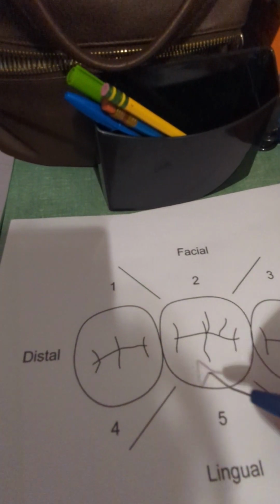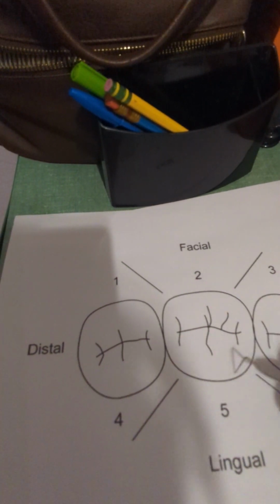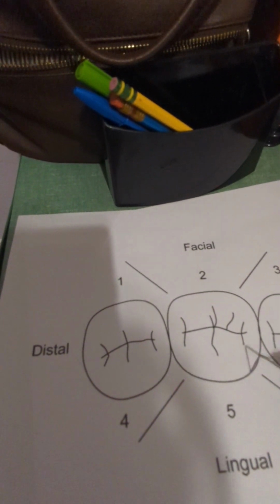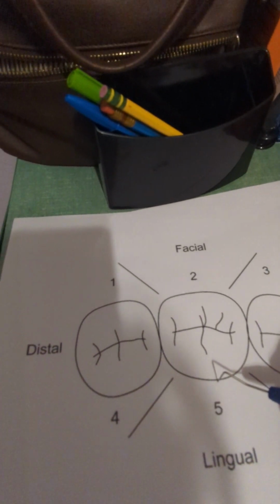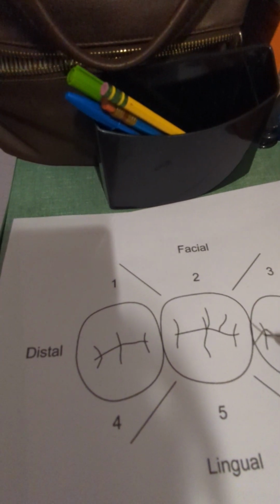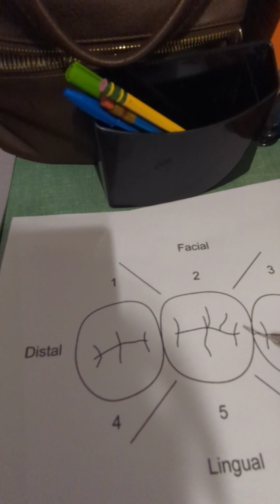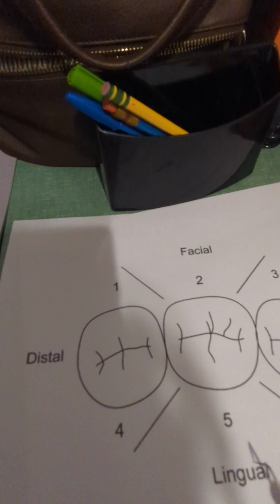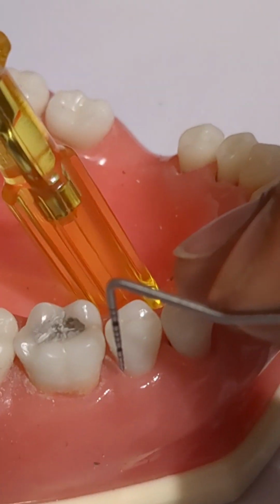Now, for the lingual surface, this area here, from the distal line angle to the mesial line angle, this is the area where you will take your measurement. The deepest depth is the one that you will use. And then you have your interproximal space. You will also take that measurement. So there's 3 measurements on the lingual and then 3 on the facial.